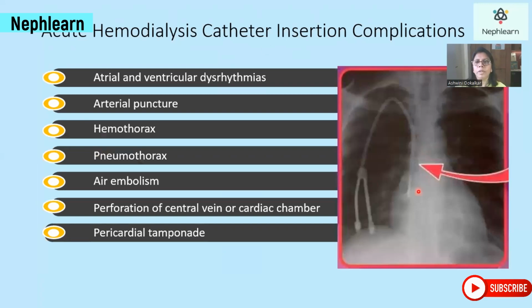So coming back to this X-ray, in which we can see the tip in the atrium and the superior vena cava and then the catheter itself. So if the tip is in the atrium, there are many points of contact, and these may cause endothelial injury and therefore, over a period of time, thrombus formation. Sometimes they may irritate the endothelium of the atrium, and they may cause arrhythmias.